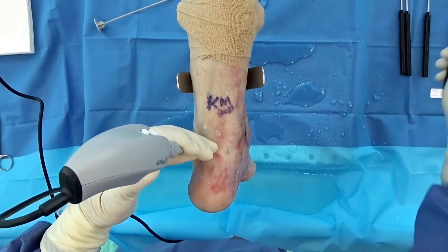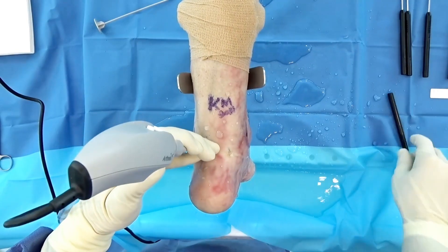You don't need to rely on that huge shaver. As with any joint fusion, you've got to stick to your principles — just because we're using a small scope doesn't mean we can avoid them. The disposable instruments are sharp; you can use either side and come in with real precision. My tools lose their ability to cut precisely very quickly, but with these little scoops you can see how precise and sharp they are. If we have trouble getting into an area, we can bend it, manipulate it, and keep driving on.